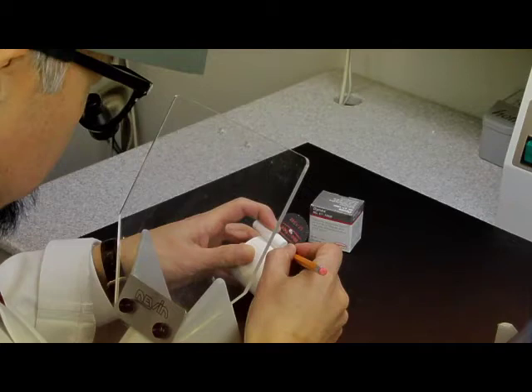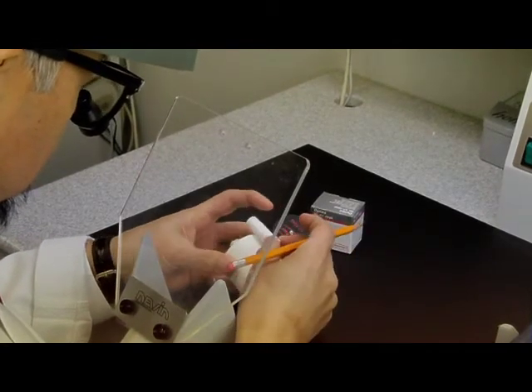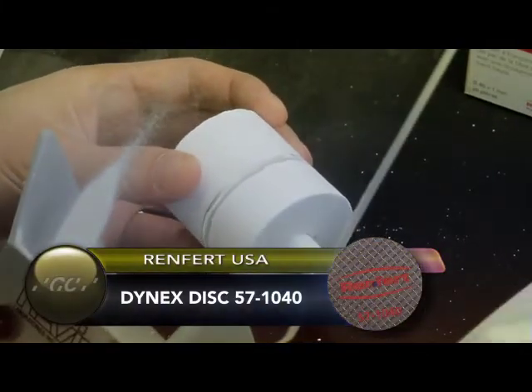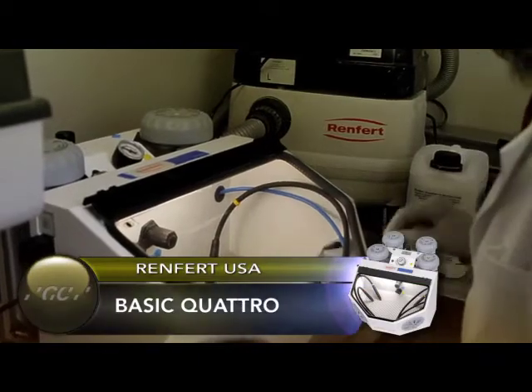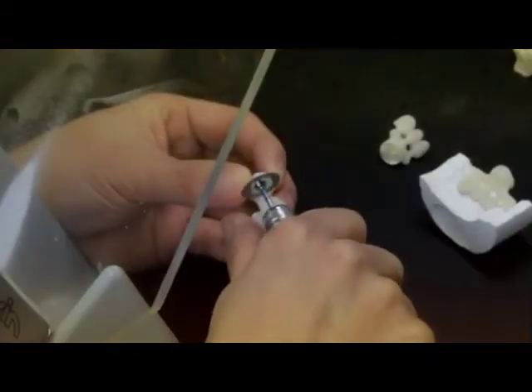After cooling, mark the length of the plunger on the investment ring and cut to separate along the length of the mark using a suitable cut-off disc like a sintered diamond disc. Afterwards, carefully break apart the two sections. Roughly sandblast the injected patterns with glass beads at 4 bars of pressure with 50 microns. Then clean the objects carefully and completely with 2 bars of pressure and 50 microns. It is important not to use aluminum oxide. Cut the sprues carefully using a suitable cut-off diamond disc.